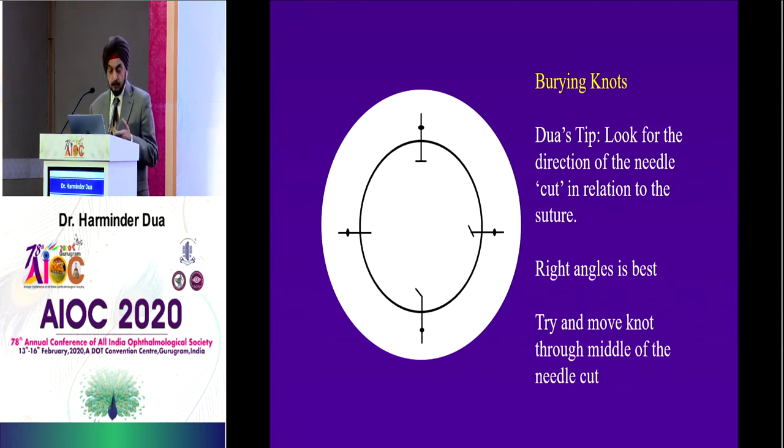It can be like that. That is very difficult to put in. So all these things will happen. So just pause to investigate and examine where your needle width cut is compared to the suture. And you will find that will go in very easily. And it's so easy. I mean, there's a video to show you how I was doing that. It's not going. Just move it to a side and it'll go in.